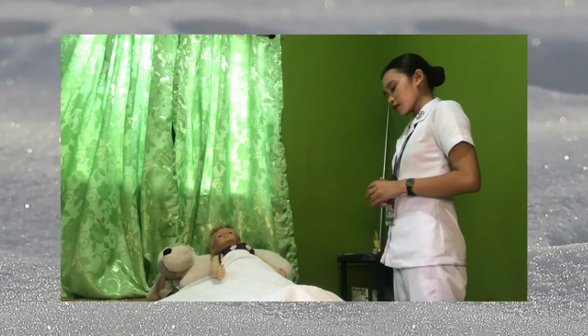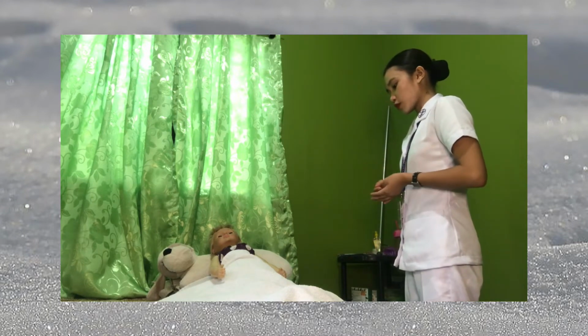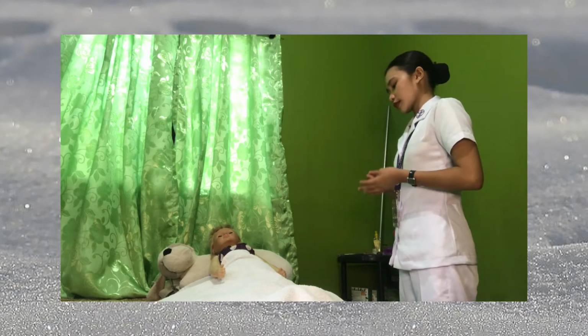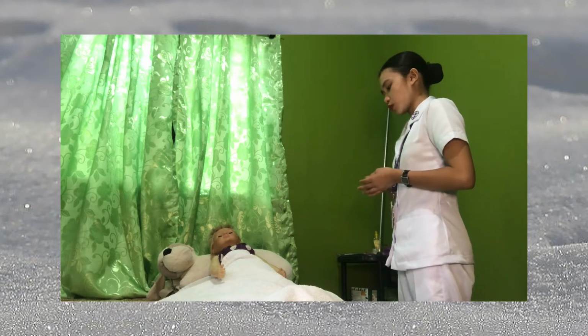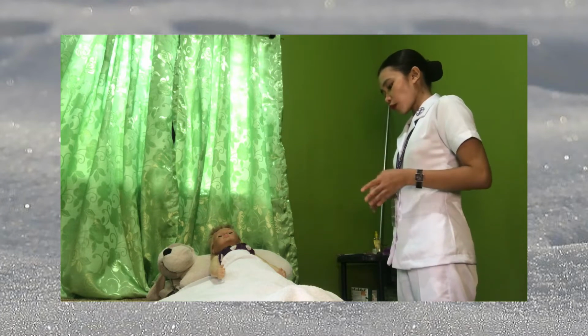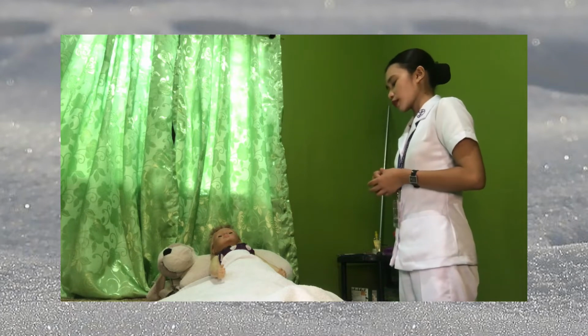Okay, ma'am, the procedure that I will be doing is the urinary catheterization. This is based on the physician's order. This will help relieve your acute urinary retention. And of course, I will be touching some parts of your body. Is that okay with you?